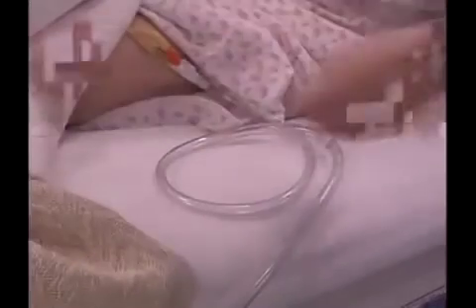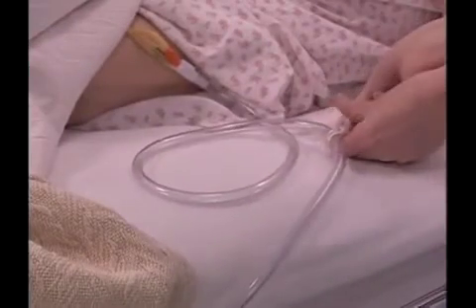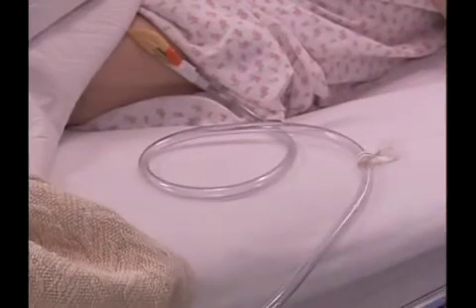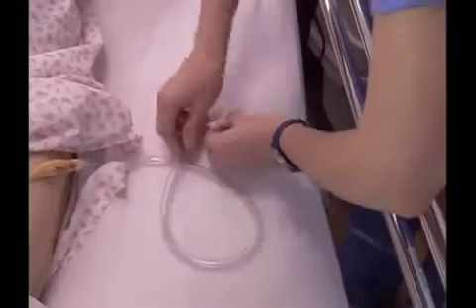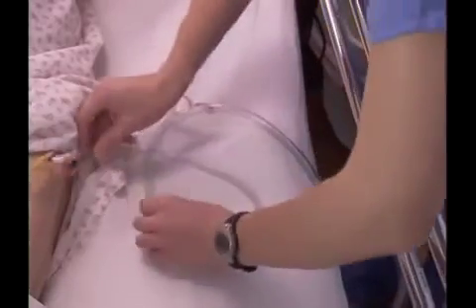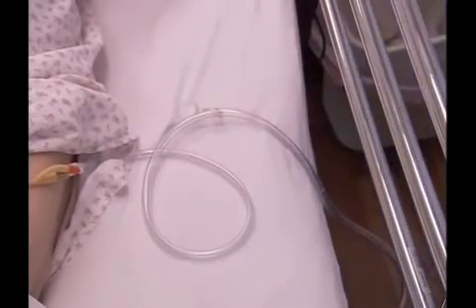When repositioning a person who has an indwelling catheter, always make sure to unclip the coiled tubing from the linens before beginning the procedure. When you are finished with the procedure, secure the coiled tubing to the linens again. At all times, make sure the person is not lying on the coiled tubing.